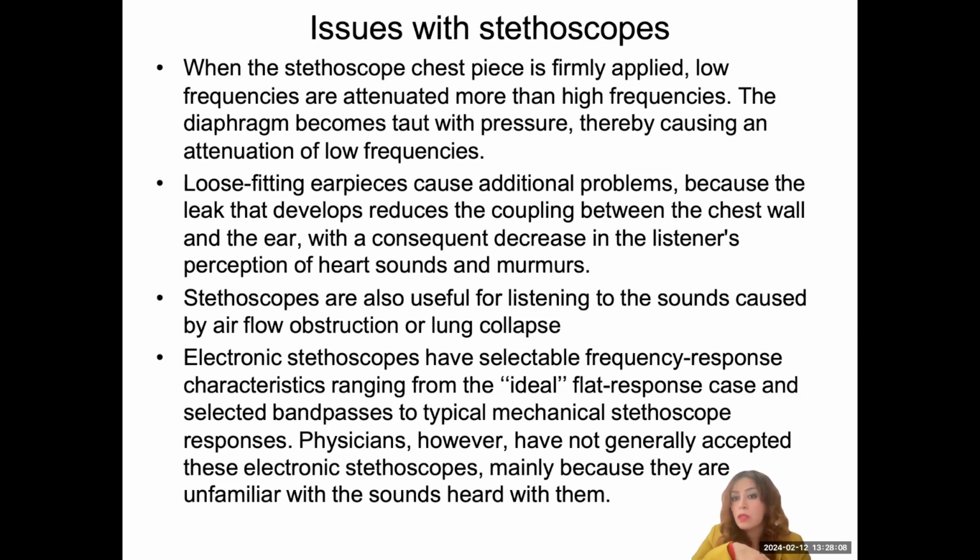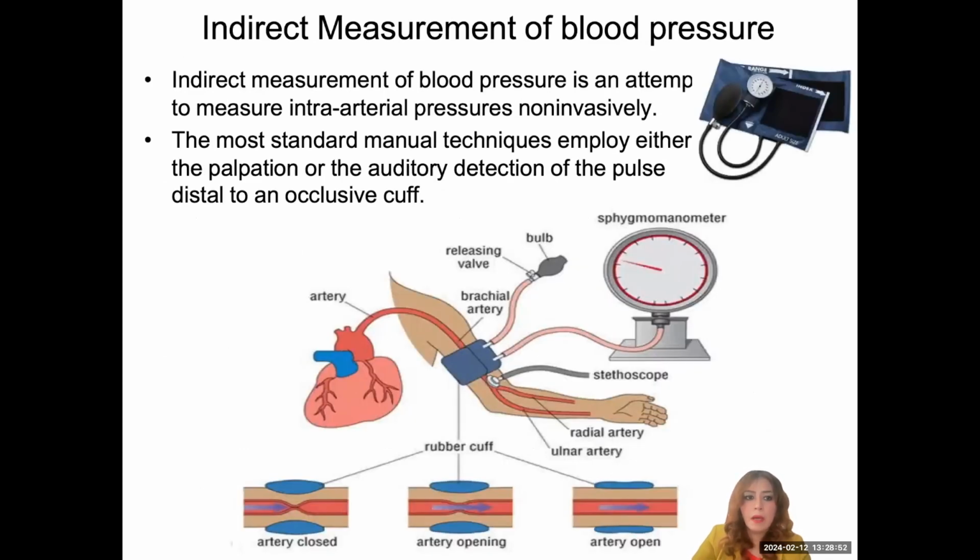Stethoscopes are also useful for listening to the sounds caused by airflow obstruction or lung collapse. The electronic stethoscope has selectable frequency response characteristics ranging from the ideal flat response case and selected band passes to typical mechanical stethoscope responses. The physicians, however, have not generally accepted these electronic stethoscopes, mainly because they are unfamiliar with the sound heard with them. They still use the mechanical stethoscope.